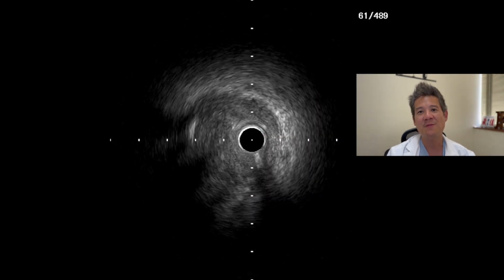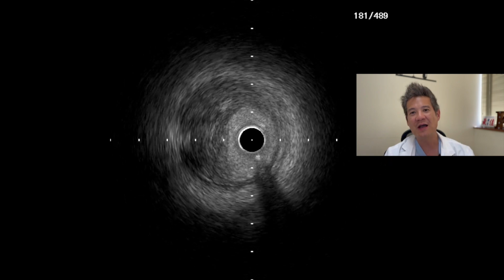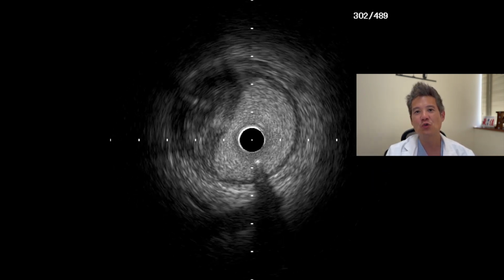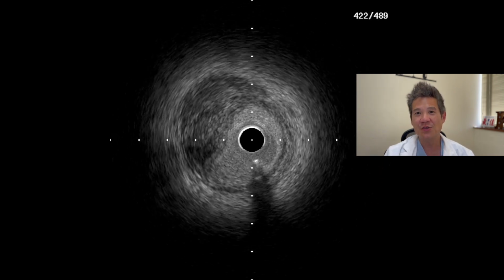So the problem is there's a septum between the intraplaque and the true lumen, and the wire is on the outer curve of the vessel, while the IVUS is on the inner curve. The true lumen is between the IVUS and the wire. So I thought that's a good time to try to use fluoro-guided 3D wiring. So use the IVUS to correspond the angles and just point the wire towards the IVUS and puncture. So that's what we did.